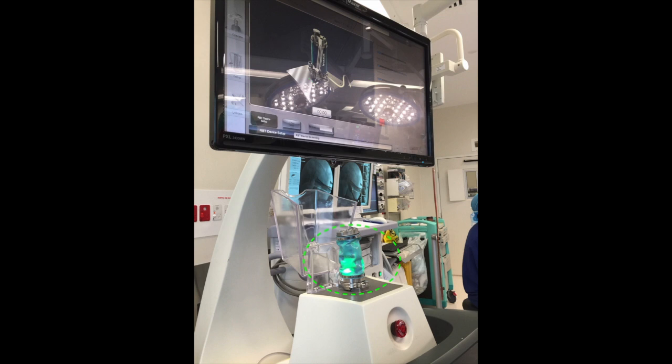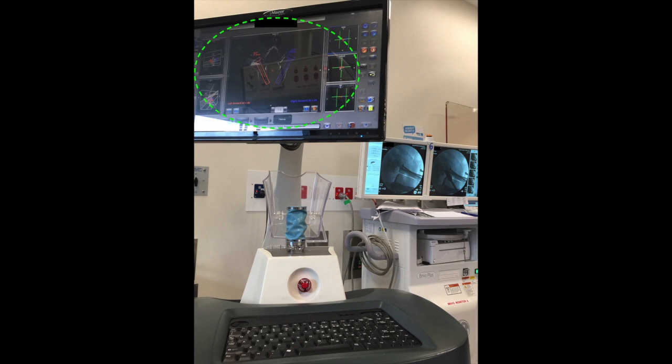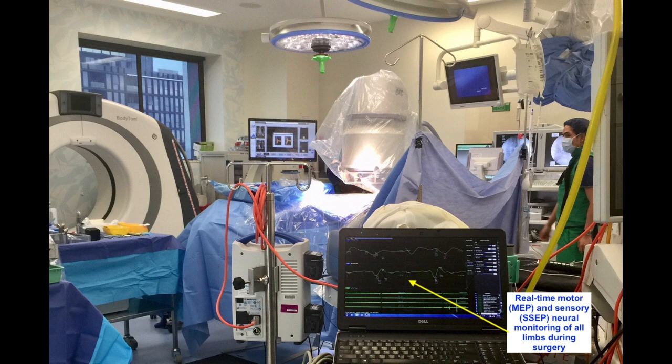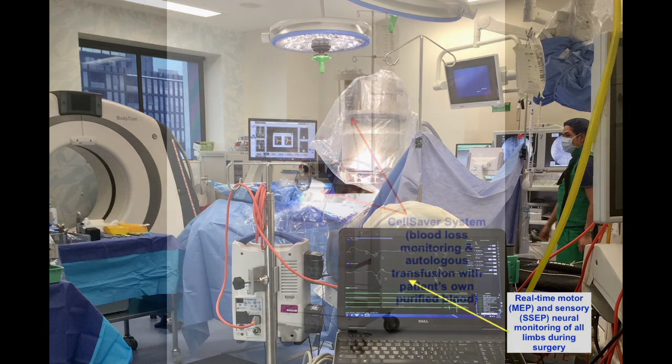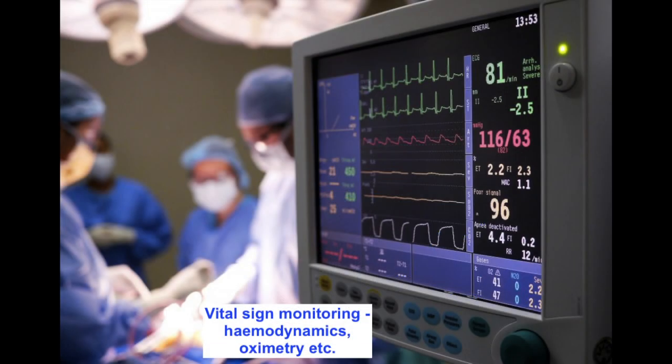The second stage was to use our robot in order to do instrumentation in a very precise and minimally invasive manner through a posterior set of skin incisions, all under neuromonitoring with cell saver autotransfusion available and hemodynamic vital parameters being monitored.